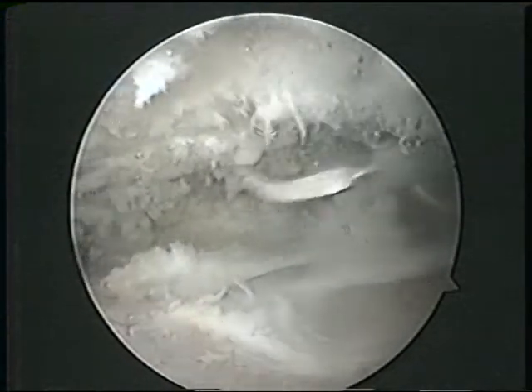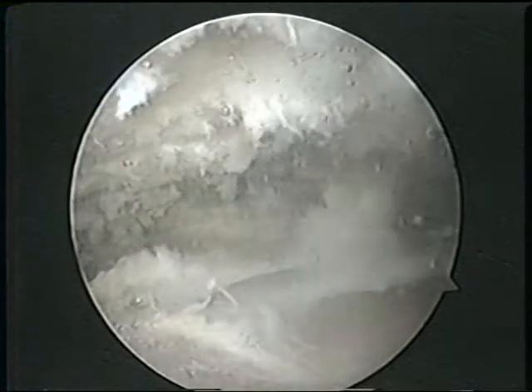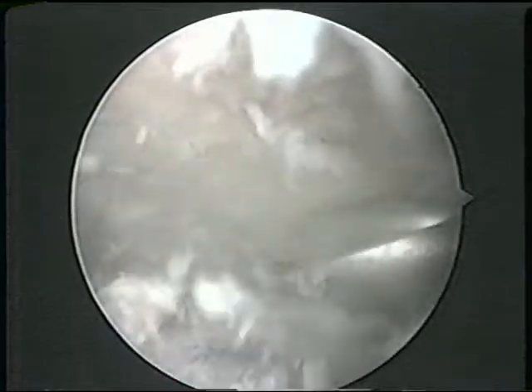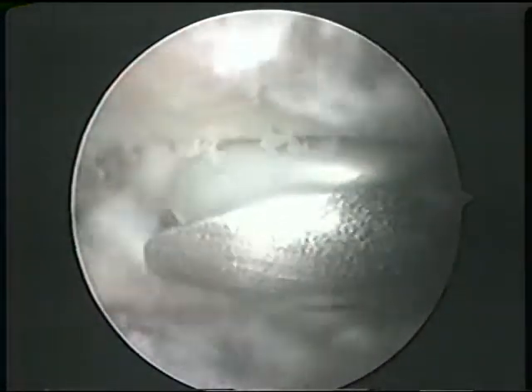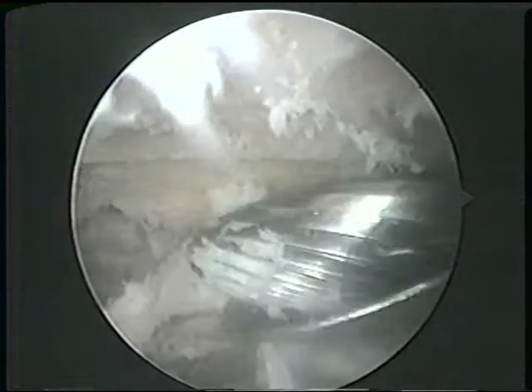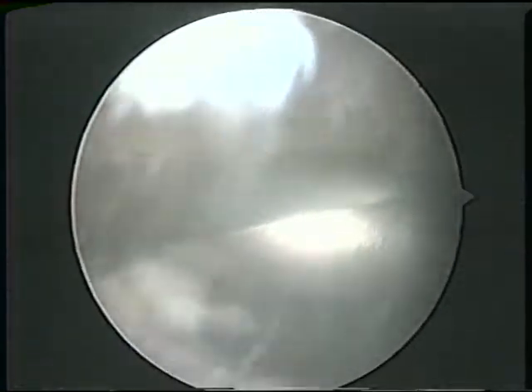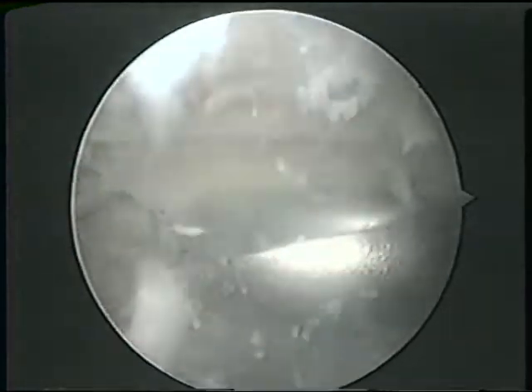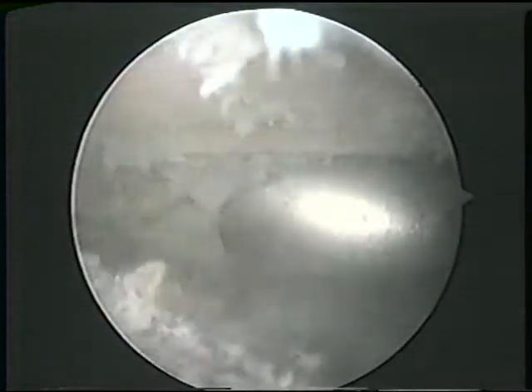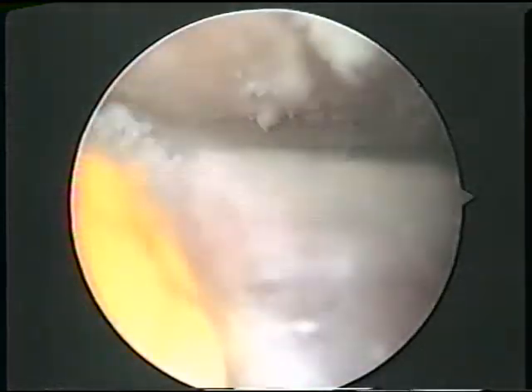Impingement can occur when the arm is brought up from behind the head, forcing the rotator cuff and the subacromial bursa to impinge on the acromion. The treatment for this problem involves raising the roof, so to speak, by shaving away bone from the undersurface of the acromion and releasing a tight ligament. This allows more room for the structures and therefore eliminates the impingement.